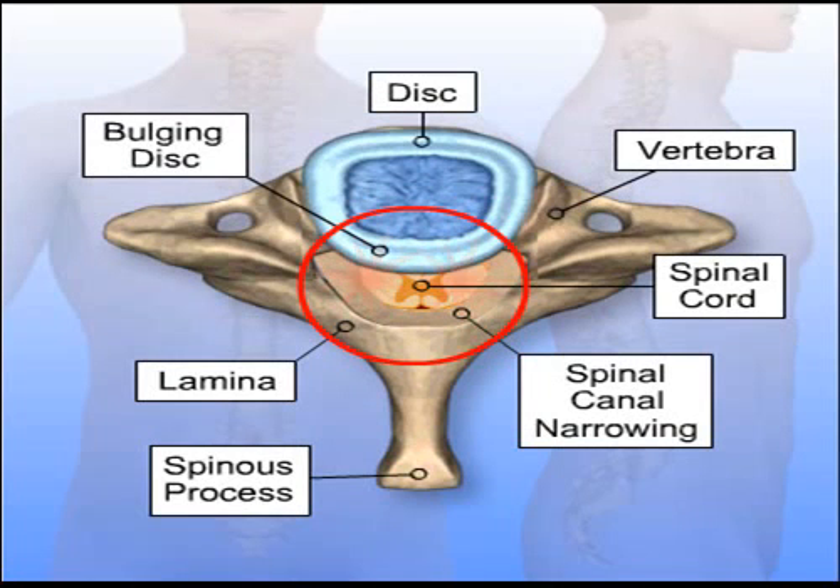After removing bone, instrumentation and bone grafts can be added to fuse the vertebrae and provide stability to the spine.